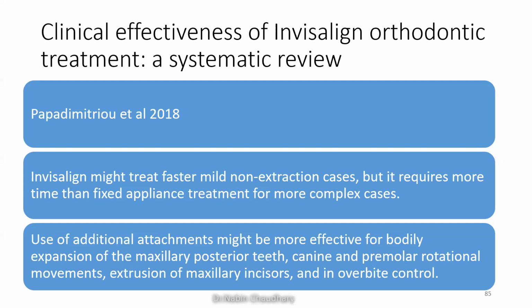Also, more additional attachments will be required when bodily expansion of the maxillary posterior teeth is required, when derotation of the canine and premolar is required, and when extrusion of the maxillary incisor and overbite control is required.